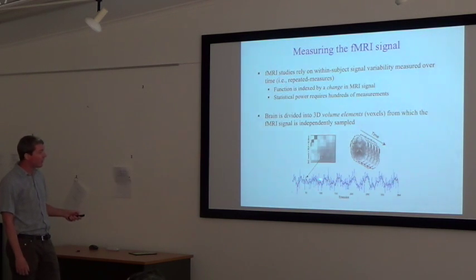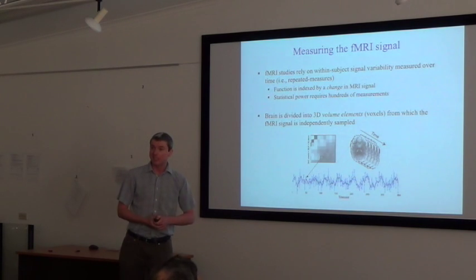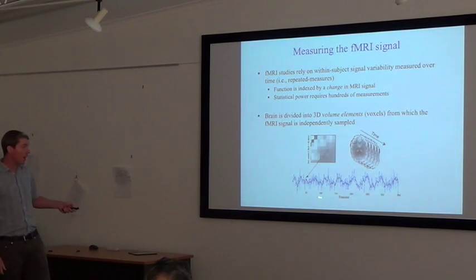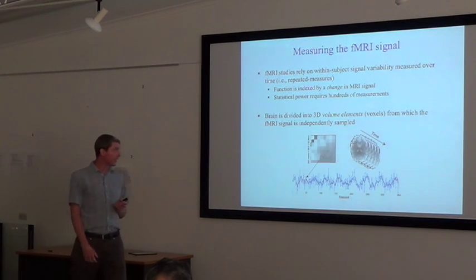But all of this noise means that we really need to get a lot of measurements to actually get something meaningful. We can actually tap into that noise in terms of functional connectivity as well, which we'll touch on here in a little while.